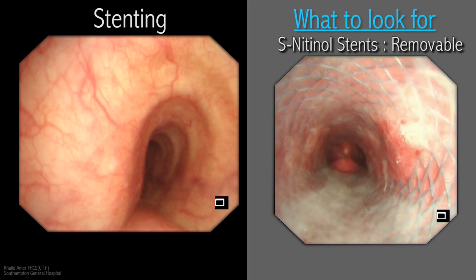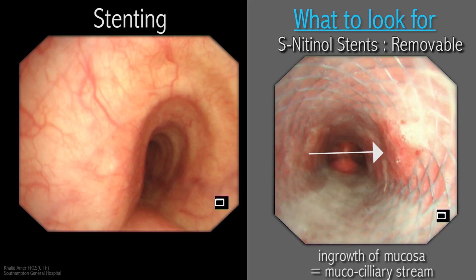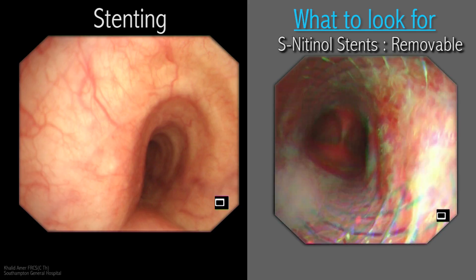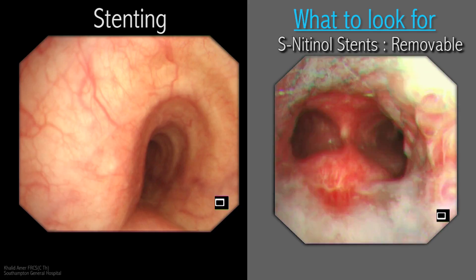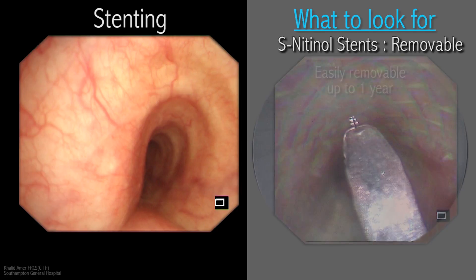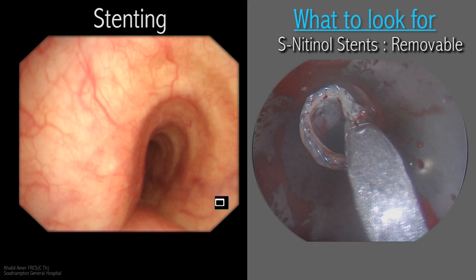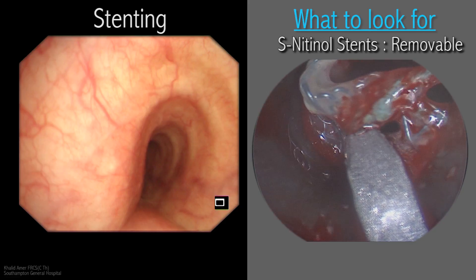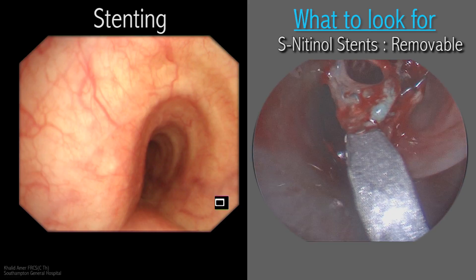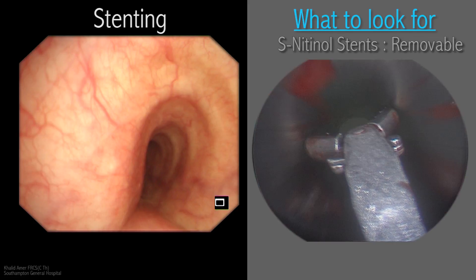At other times, patients simply do not tolerate the stents at all — they suffer from continuous, irritating cough — and in that case removal of the stent should be considered. One should note the ingrowth of ciliated respiratory epithelium or mucosa through the metal framework, which helps establish the mucociliary stream, resulting in less mucus retention with non-covered metal stents compared to covered ones. Stent removal follows the same principles of foreign body removal: the stent is withdrawn inside the rigid scope, and the whole mechanism including the rigid scope is withdrawn out of the patient.